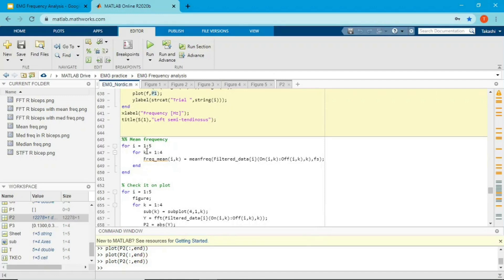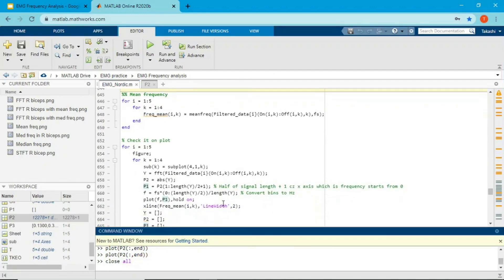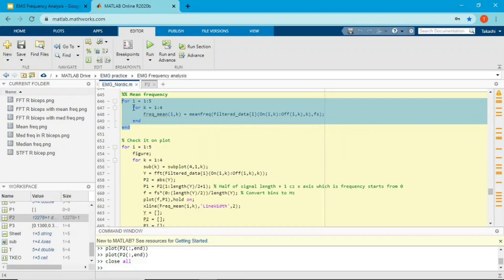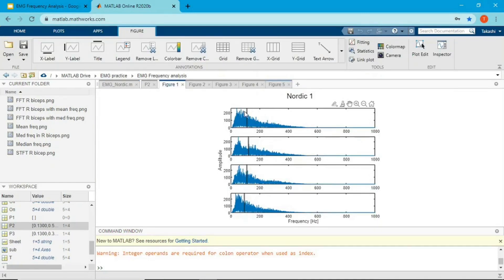After FFT I'll conduct mean frequency analysis using a function called meanfreq. The input argument is the filtered data with duration defined from muscle on to muscle off, and the second input argument is the sampling frequency of 2000. The meanfreq function finds mean frequency muscle by muscle and trial by trial.